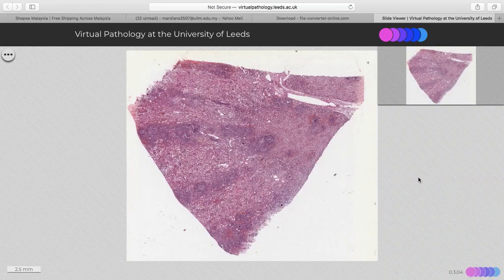This is an example of an abscess within the kidney, so renal abscess. This is a section of the kidney, and on low power you can appreciate that there are multiple foci of bluish cellular infiltrate, and in the background it's slightly more pinkish and reddish due to hemorrhage.